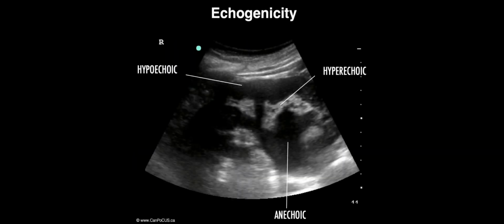This is a scan of the kidney with hydronephrosis. I'm using this image to introduce the common terminology used when describing a structure's appearance on ultrasound. The normal renal cortex is relatively hypoechoic. The renal sinus is relatively hyperechoic.